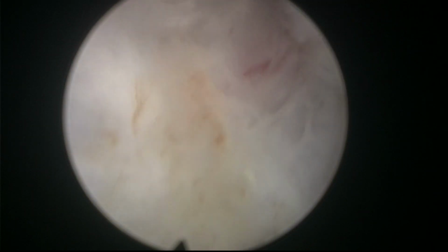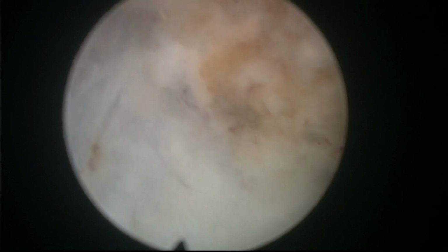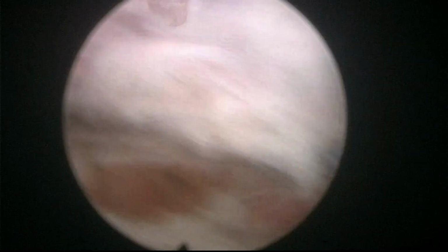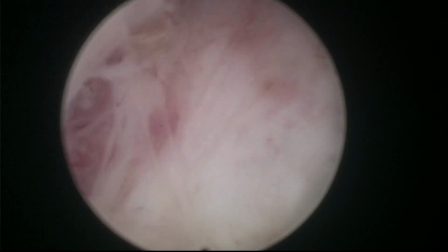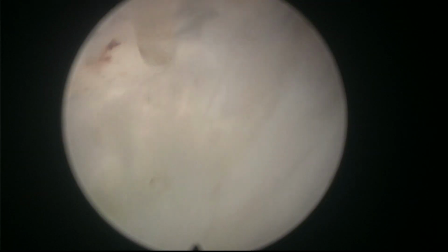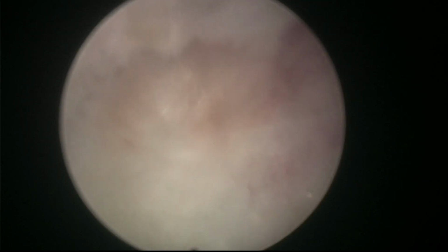So things are getting better now that we have removed this nodule here, and to try to connect with the previous plane. You see here we are under the nodule. There's still maybe some little attachment there. Let's see how we are progressing. As I said, sometimes you liberate on the other side, the prostate gains mobility, you can tilt it into the bladder, and then accessing difficult areas can be easier. Here again we continue. It's a very nice looking plane up to the bladder neck, I think.